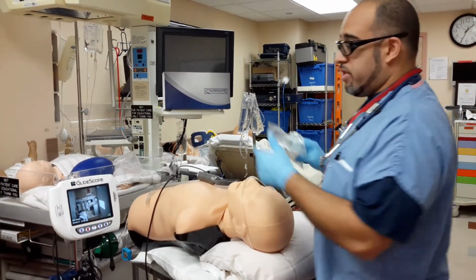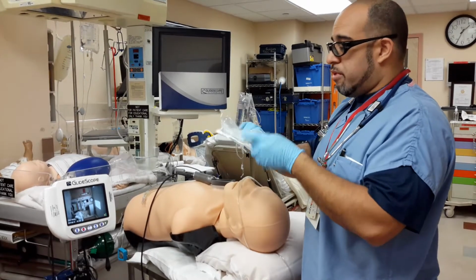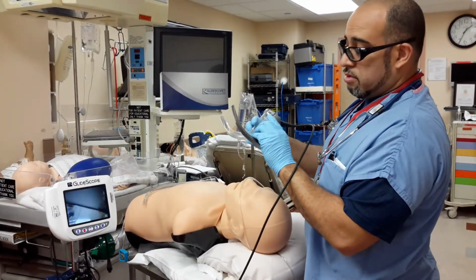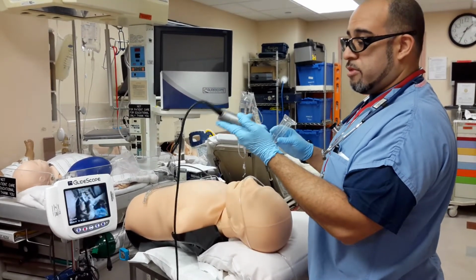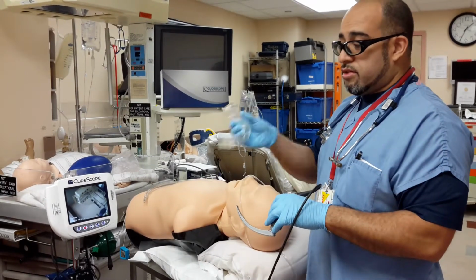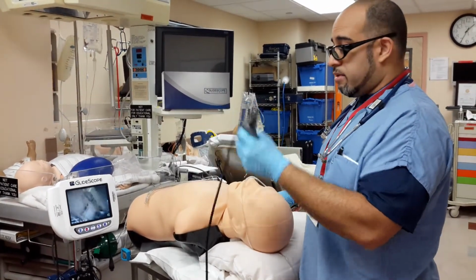Remember, I gotta remind myself, this is a Glidescope. I won't be pulling out a size 4 Cobalt Ranger GVL 4-stat. I won't be pulling out the blade that's been suggested for so long. I'll be pulling out this blade. Notice the difference? Okay? But this blade I've been using since I've been taught how to intubate. This blade takes some time to use, some experience, and some practice, and then you become very successful in using this device with this type of blade. This is disposable again, plastic, disposable, non-disposable, metallic. Okay?